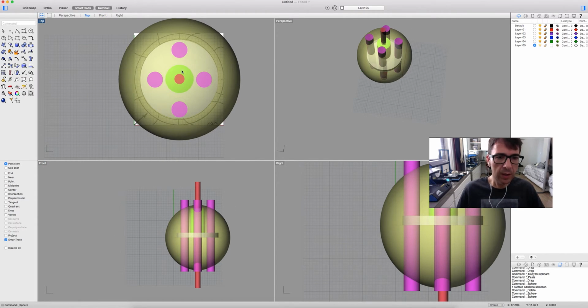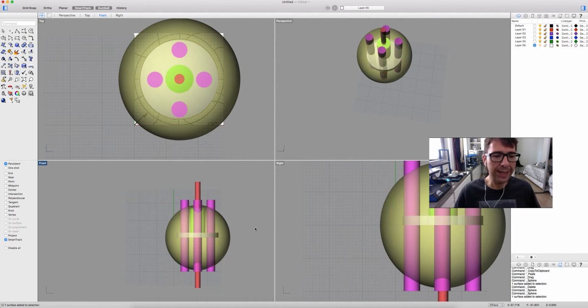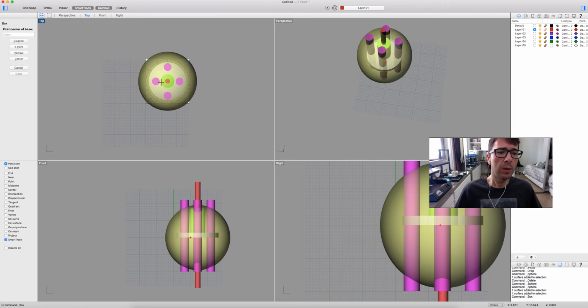the sphere. But the glenosphere is not a complete sphere. The glenosphere is a half sphere. So let's cut this sphere in half. Where? Just in the middle of the glenosphere. So we're going to design a square, a box here over the glenosphere.